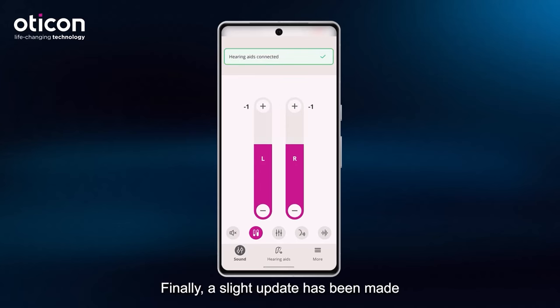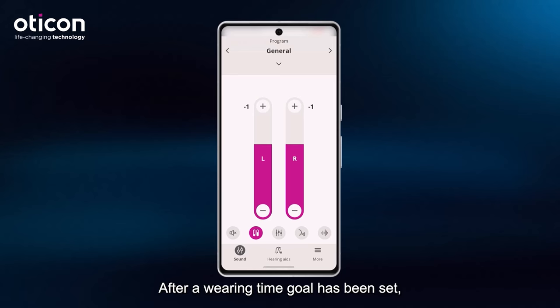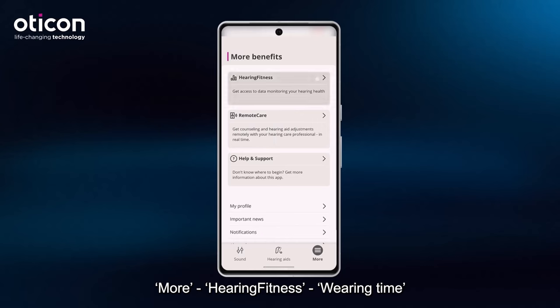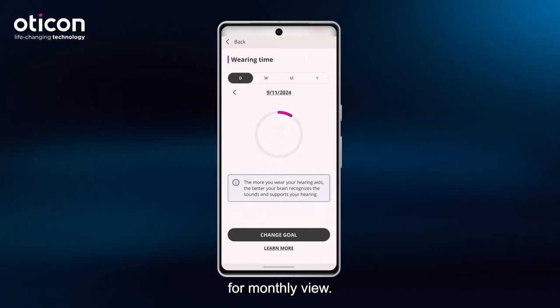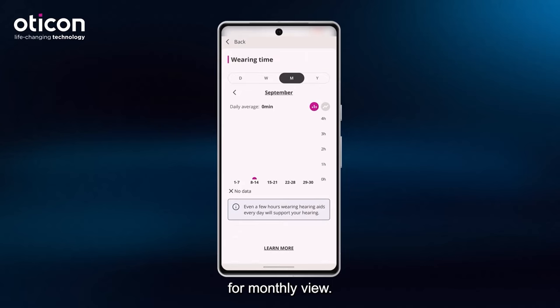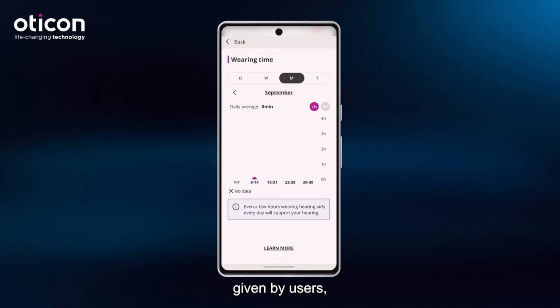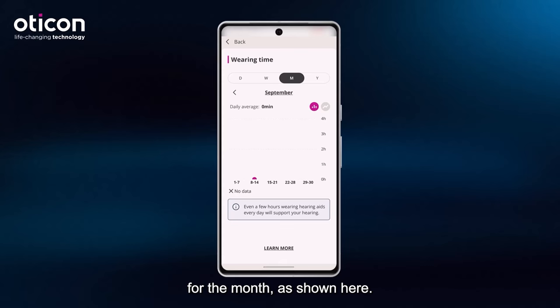Finally, a slight update has been made to the Hearing Fitness monthly view. After a wearing time goal has been set, the monthly view can be accessed by tapping on More, Hearing Fitness, Wearing Time, and tapping on the letter M for monthly view. Previously, we could see a calendar on the bottom half of the screen, but based on feedback given by users, it was decided to remove this calendar. So now we simply see the bar graphs for the month, as shown here.